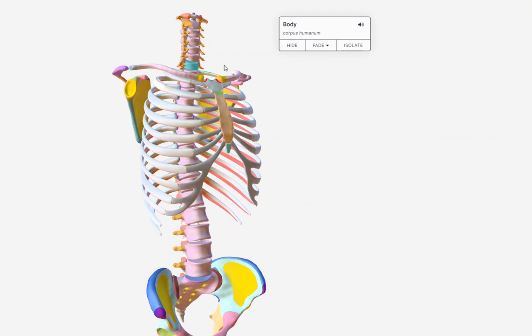So now the left posterior side is touching the wall Bucky. That is an LPO, left posterior oblique. The patient's right side is rotating up toward us, away from the Bucky.